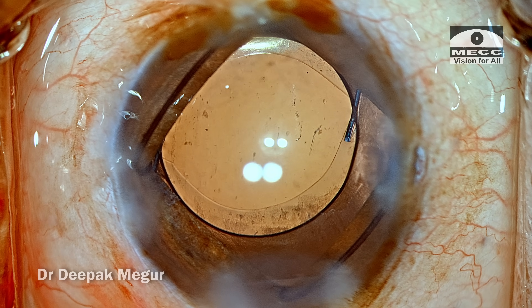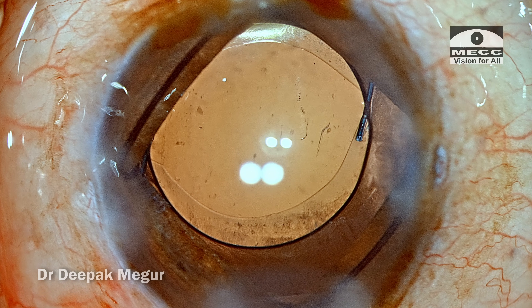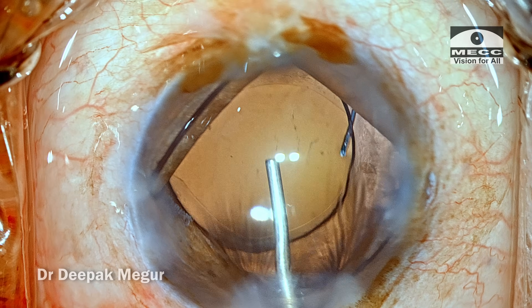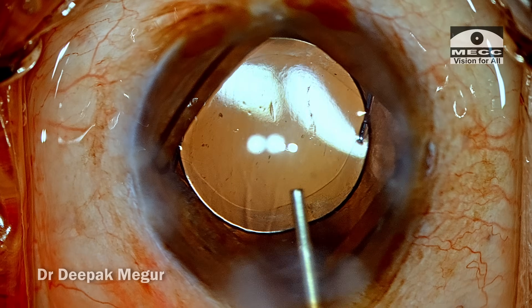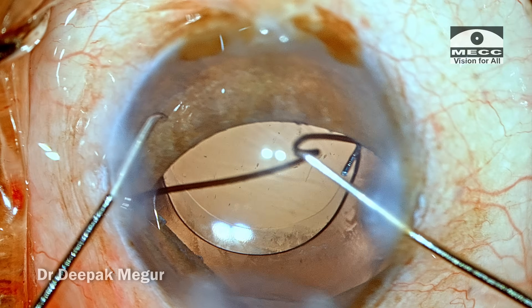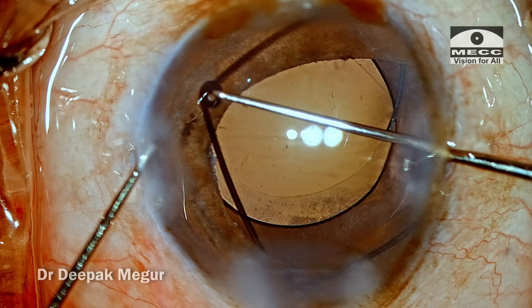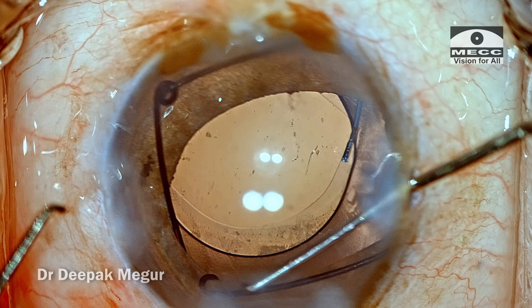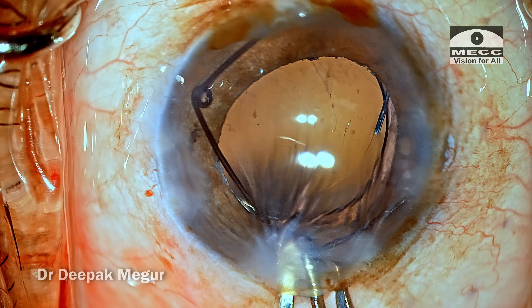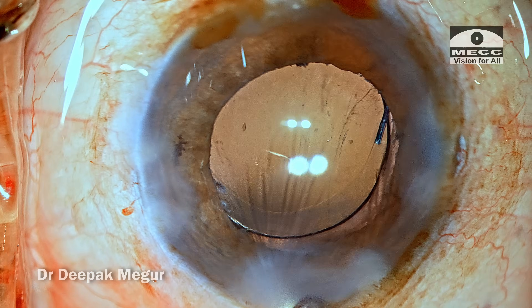Ovalization of the rhexis confirms that the optic is trapped behind the rhexis margin. The haptics are in the sulcus. At this stage it looks like the rhexis was slightly off-center, but nevertheless the sizing was accurate so that we have a very secure trapping of the intraocular lens optic. Now is the time to remove the pupil expansion device. I do it under the cover of OVD — not under irrigation with BSS — simply because this is a bulky device and not so easy to expand out. The notches are all disengaged from the pupillary margin, and using an iris spatula, the posterior lip of the main incision is pressed down along with the iris and the ring is safely navigated out.